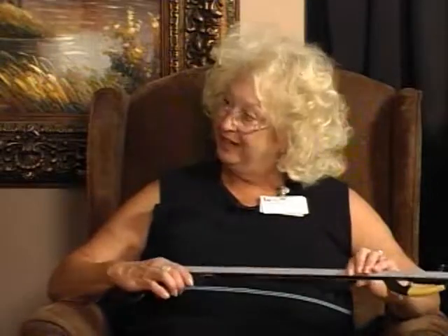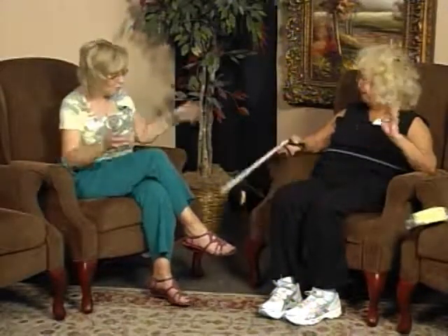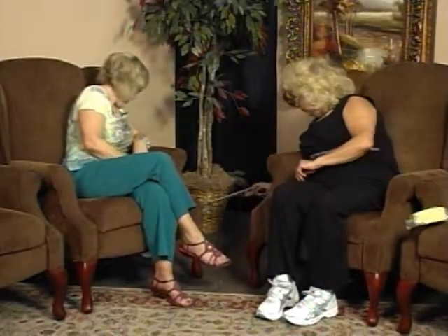I'm telling you, I've been a therapist for 37 years, and I have never not had one of these in my home. I think that's a wonderful idea. What do you call it? It's a reacher. Just a reacher. No special fancy name. And if you could not reach your water, I would be glad to assist you.